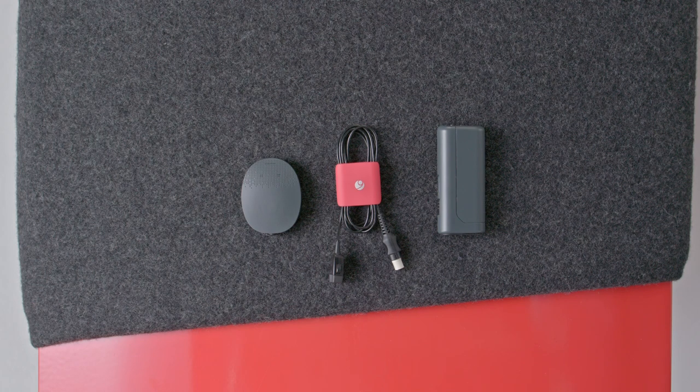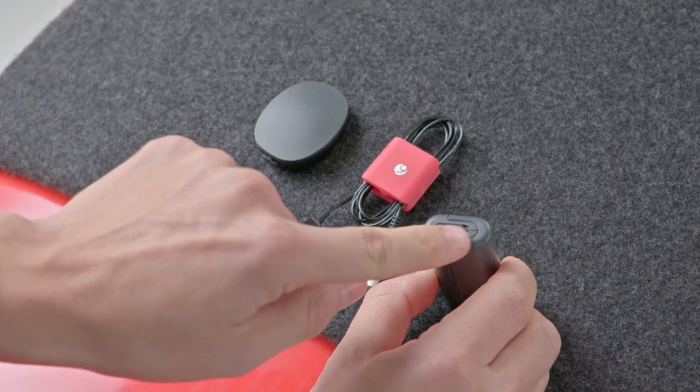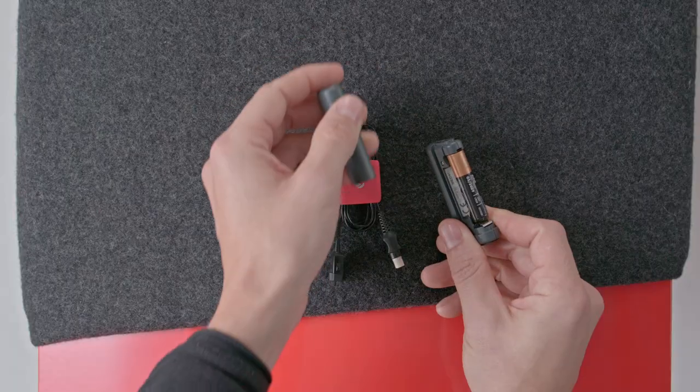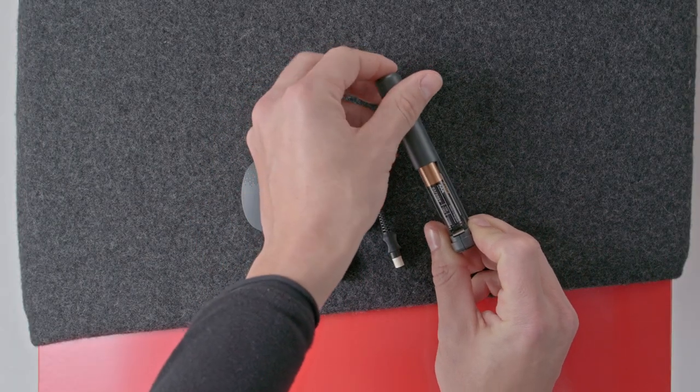To use the Mini Battery Pack, first slide the on-off switch to the off position. Then remove the battery compartment cover. Insert a AAA battery or DeCapo battery pack into the Mini Battery Pack.